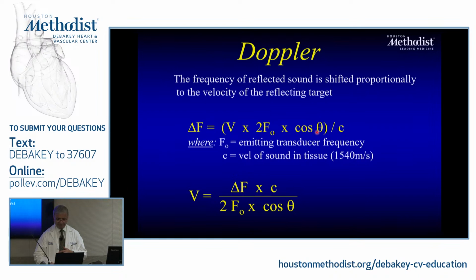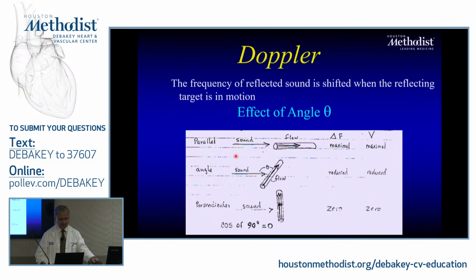Got it? All right, so what do we do in real life? In the old days, the scale was a frequency shift scale. Nowadays, you see velocity. It's already solved for you, provided that your angulation is minimal. It's not including angulation, so you have to work yourself to make sure that the images that you acquire have the least angulation.